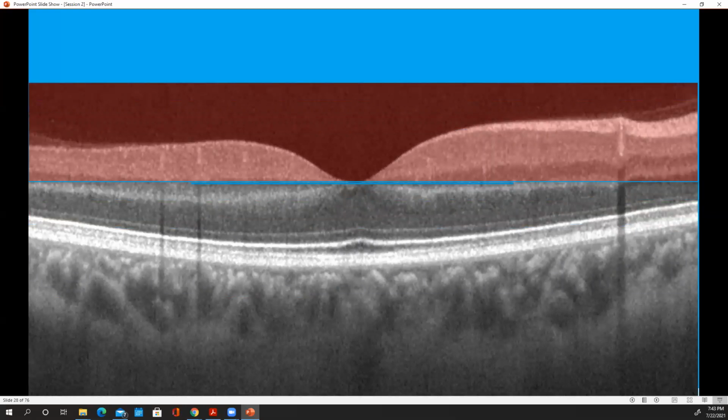Now, again, using my ridiculous club analogy here, if you're really, really inside the club, you're VIP, okay? And you get a special name. You're not just in the club, you have special names. But if you're like in line or just got into the club, you're designated like the schmo who gets in the club. You're still just an inner, right? So in this case, this dark band is touching the line. They're in line, that foveal tangent. So I'm going to say he's in the club. He's an inner, but he's not so far in the club that he has a different name. Like he's in the VIP section, so he gets to change his name or something.